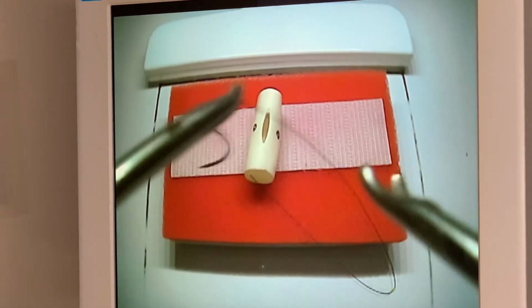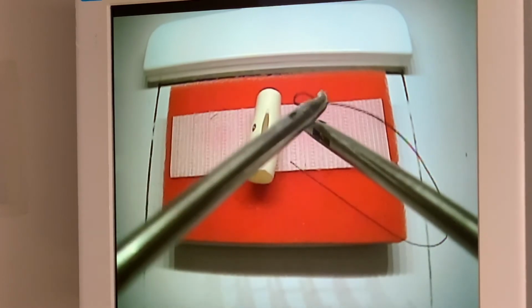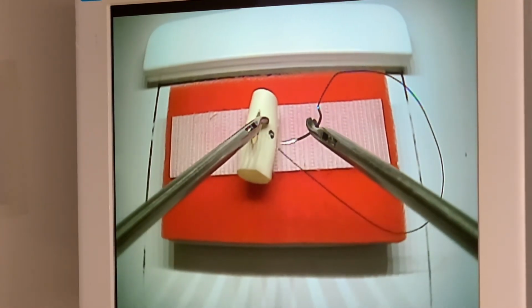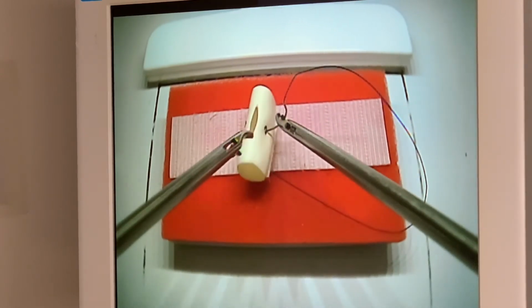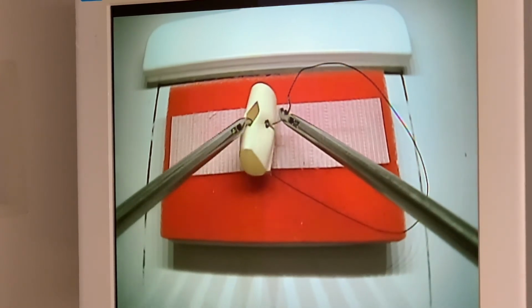Task 5. Intracorporeal knot tying. Taking a short suture and your needle drivers, you will place the suture through both ends of the Penrose drain and tie 3 knots. The first knot will be a double knot and the following 2 knots will be single knots. After, you will cut the excess suture.